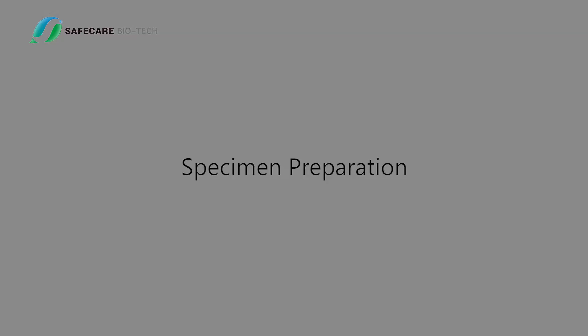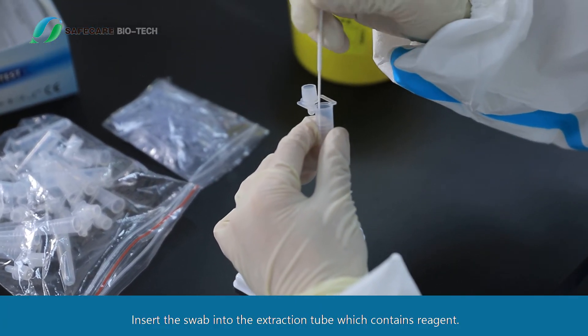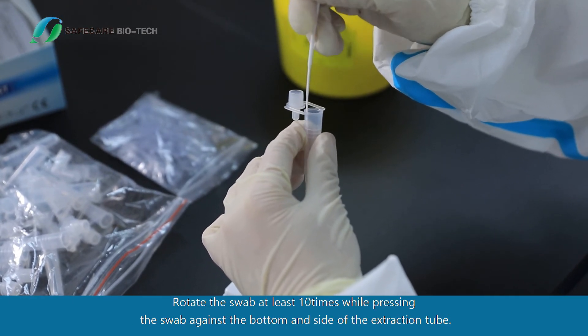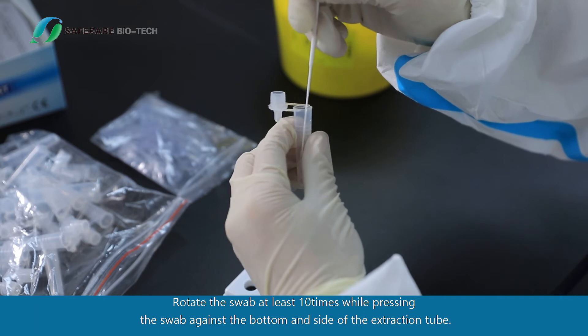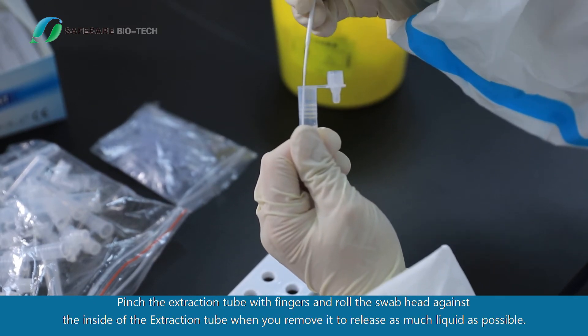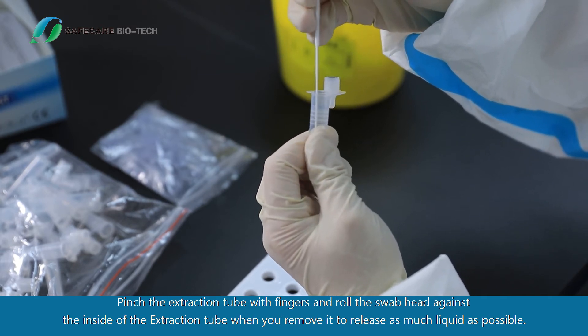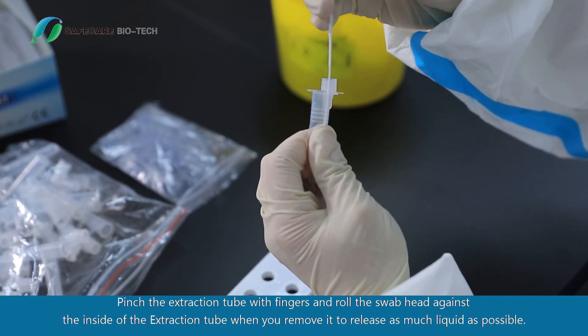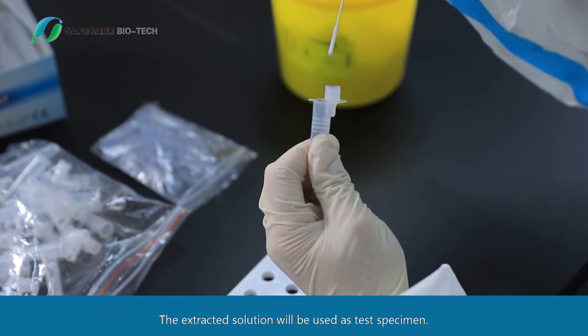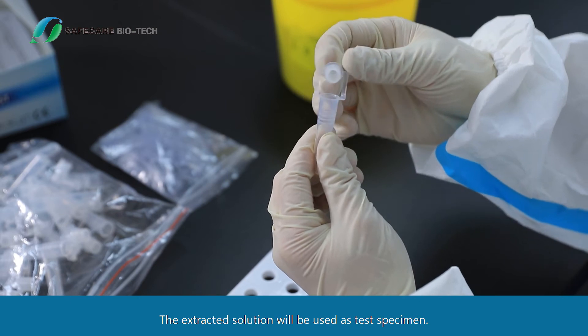Specimen Preparation: Insert the swab into the extraction tube which contains reagent. Rotate the swab at least 10 times while pressing the swab against the bottom and side of the extraction tube. Pinch the extraction tube with fingers and roll the swab head against the inside of the extraction tube when you remove it, to release as much liquid as possible. The extracted solution will be used as the test specimen.